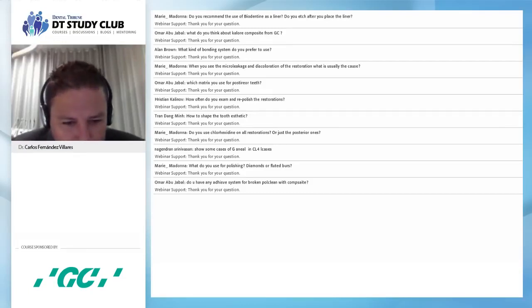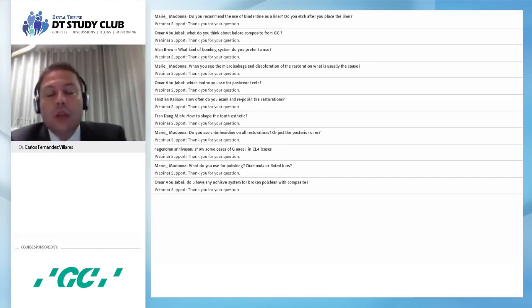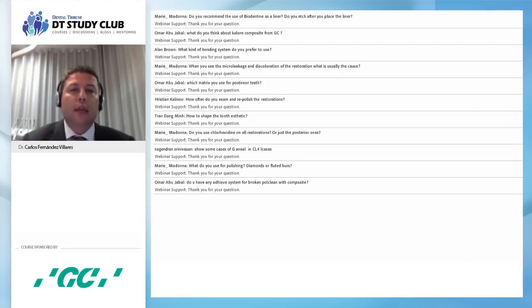Tran Dan asked me, the color of resin we choose is the same as the patient's, so it's so difficult. Do you have any tips about this? Okay, as I showed you in the presentation, I use the Italian lamp called Smile Light. It's a polarized light that allows me to eliminate some of the reflection of the enamel, and then allows me to get a better, real color.